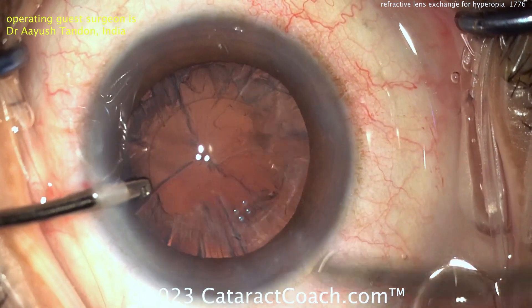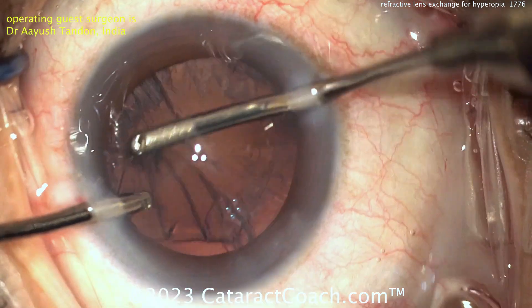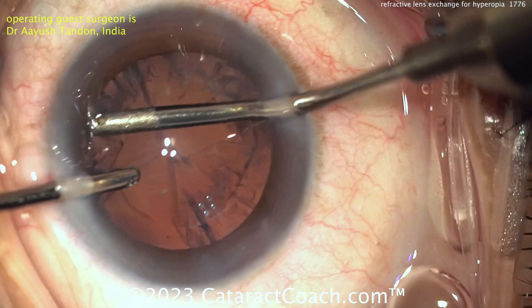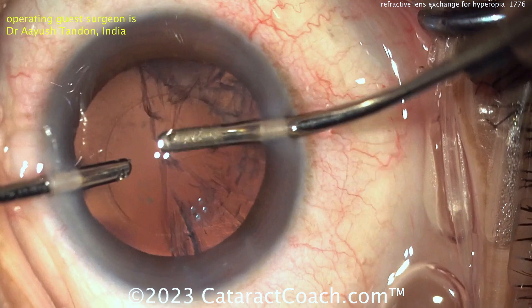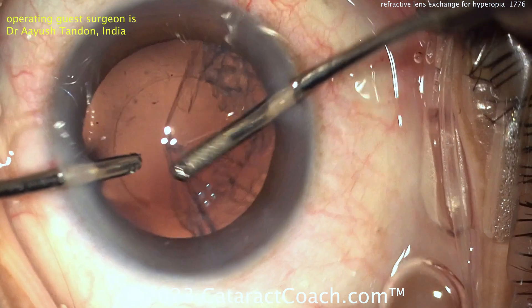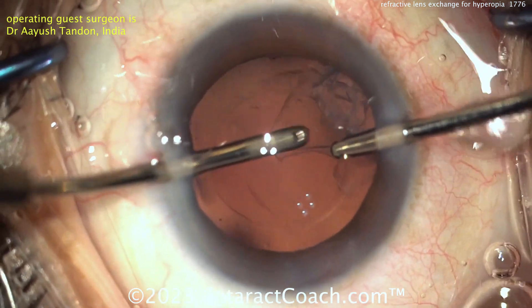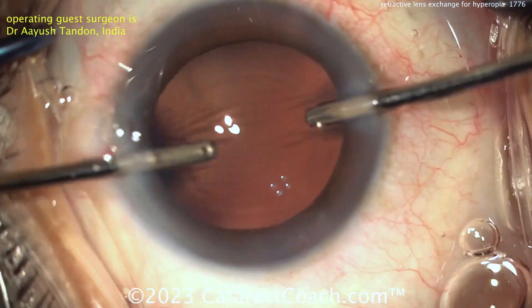These lenses do come in toric powers as well — we'll see at the end if it's toric or not. If it's not toric and the patient has 0.5 or 0.75 diopters of astigmatism, you probably want to address that too. You want these refractive patients to be as close to absolute emmetropia or plano as possible — that means more than just spherical equivalent plano; don't leave them with residual astigmatism. The lowest toric power in the U.S. is about a diopter at the corneal plane, so if the patient has less than that, fix that astigmatism.